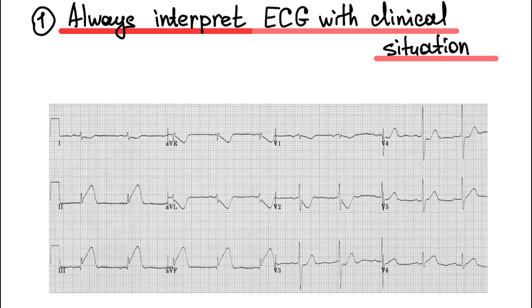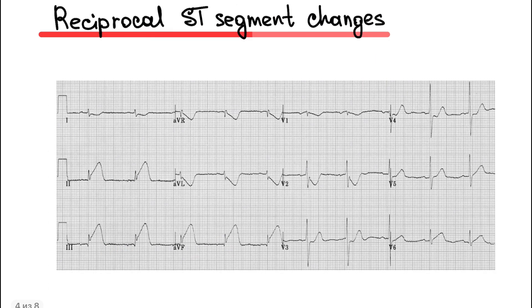Look at this ECG. We can see ST segment elevation at leads II, III, and aVF. If the person has ischemia-like symptoms, we think about acute coronary syndrome with ST segment elevation. One more feature: if it is acute coronary syndrome, we can see reciprocal ST segment changes on the ECG, such as ST segment depression at lead I and aVL.